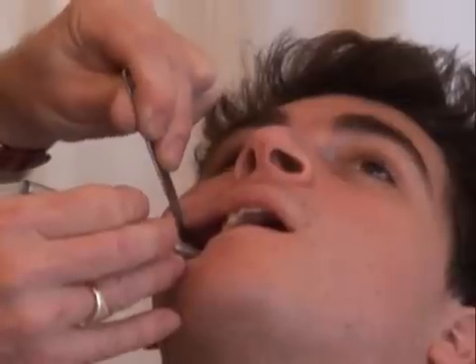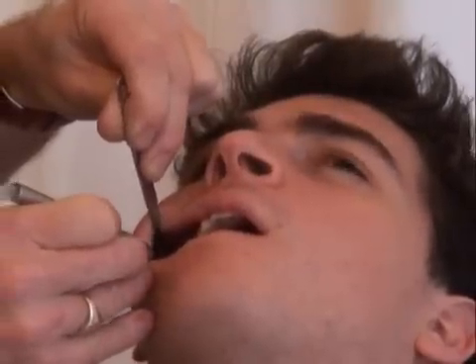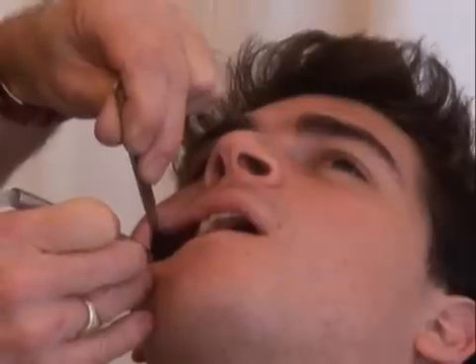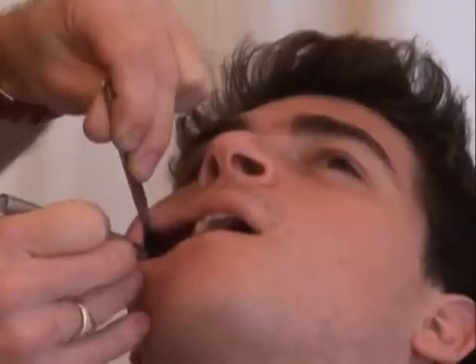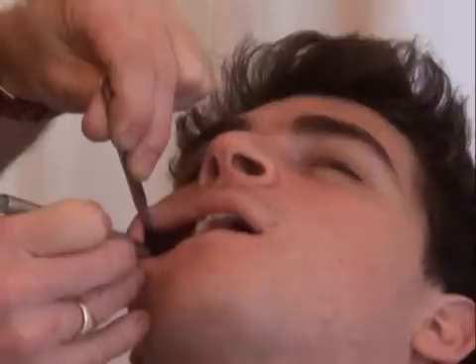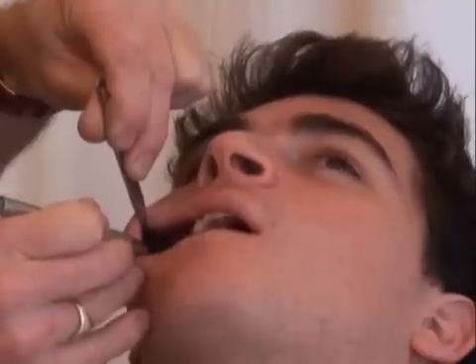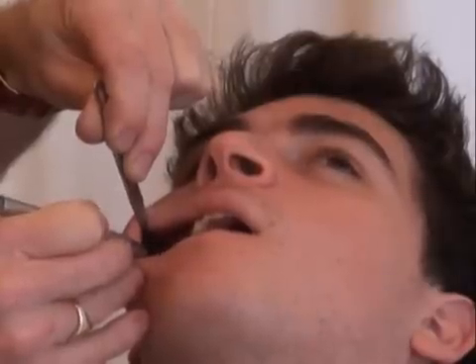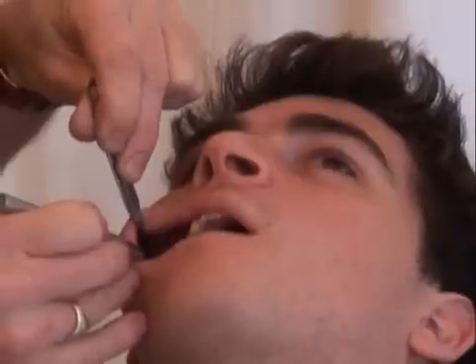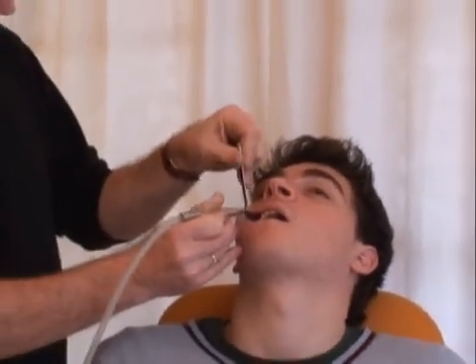If you had a small area of sensitivity along the side of a tooth, which is actually very common, we can just treat that with ozone. I'm going to use it almost like a gas squirt, just across that area where it plugs into the gum tissue. You can then lick that and go off and chew ice on your tooth and you wouldn't even notice it. That's how simple it is.